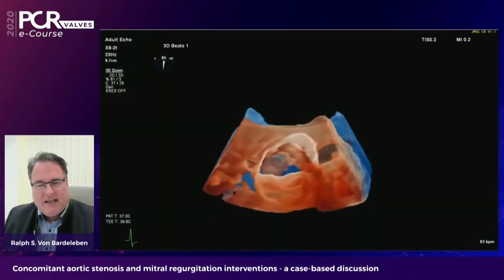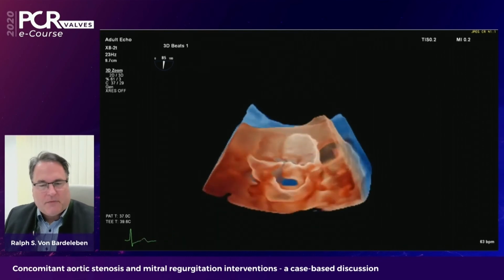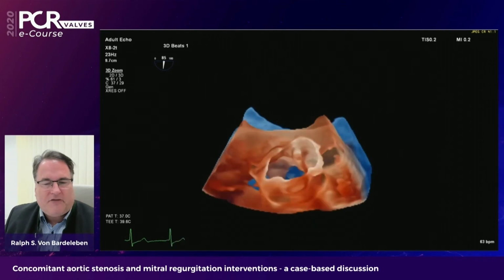Can you tell us more about what is probably the future? I think we're heading away from normal two-dimensional echocardiography, a black and white snowstorm 20 or 30 years ago, towards more and more anatomy. And we're going to the surgical look and feel of a procedure without opening the chest. We see the most beautiful access here to a valve, and we see the coronary ostia leading from that. And look at the leaflets of an aortic valve moving. It gives you a torque and twist and a totally different appreciation.